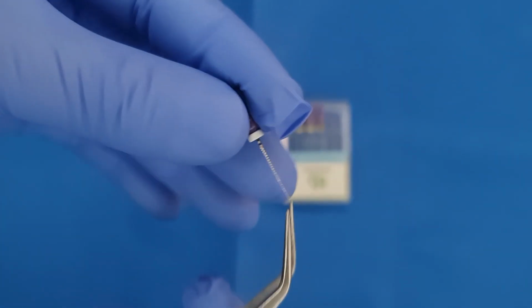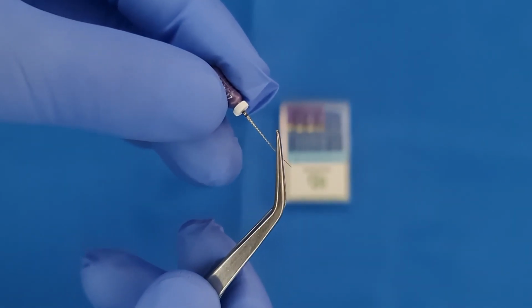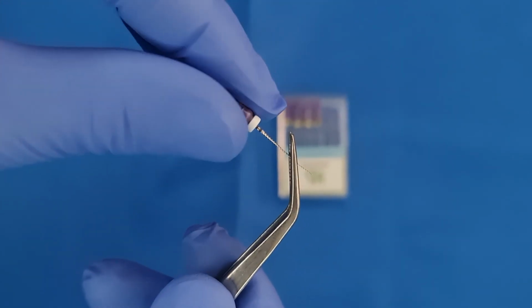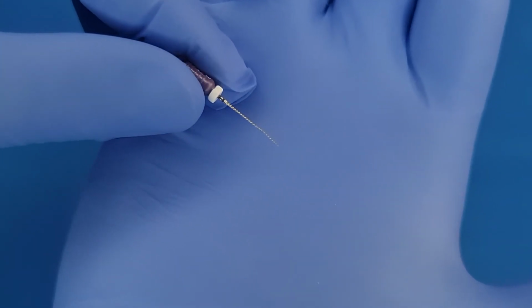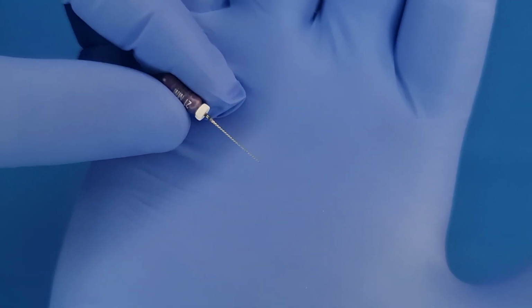I am going to take this and rotate it in a clockwise motion. You can see that it has been rotated 3 times, and there is a shiny surface indicating that it is unwound. It is very clearly evident. So if you use it further, it will definitely fracture.